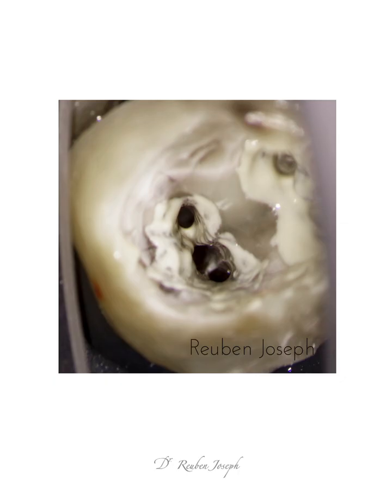The next thing is, I would delay the image capture as far as the obturation part, where I would have painted the root canals with sealer, and of course all sealers are light colored and they are also going to throw back a lot of light and make the image a lot more clearer.